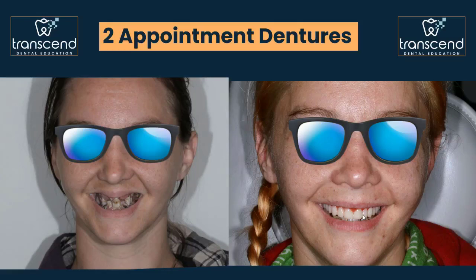I mean, what else do I need to say to get you to buy into this digital denture stuff? To me, that is a no-brainer. Is there a learning curve? Yeah, there's a learning curve with everything in dentistry, period. I've seen lots of doctors that were not that tech savvy grasp this process and go on to do this. So it's not rocket science.